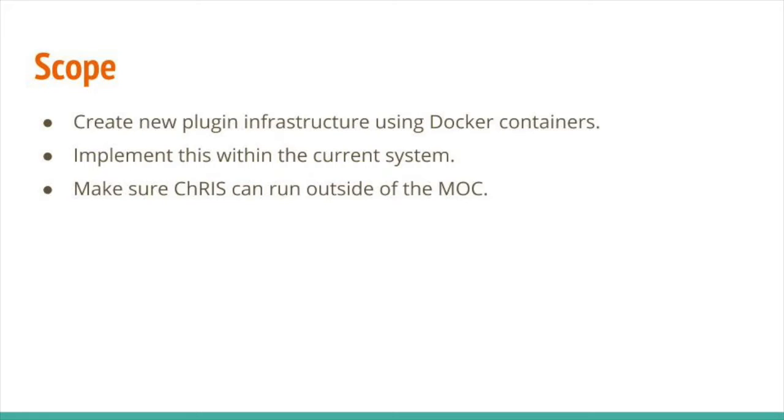Initially, we ran into a few issues with getting the base CRIS image to work on the Massachusetts Open Cloud. Certain aspects of the architecture were changed from last year, which made the process substantially more difficult and involved. Eventually, however, we were able to get CRIS up and running on the cloud server without an issue.